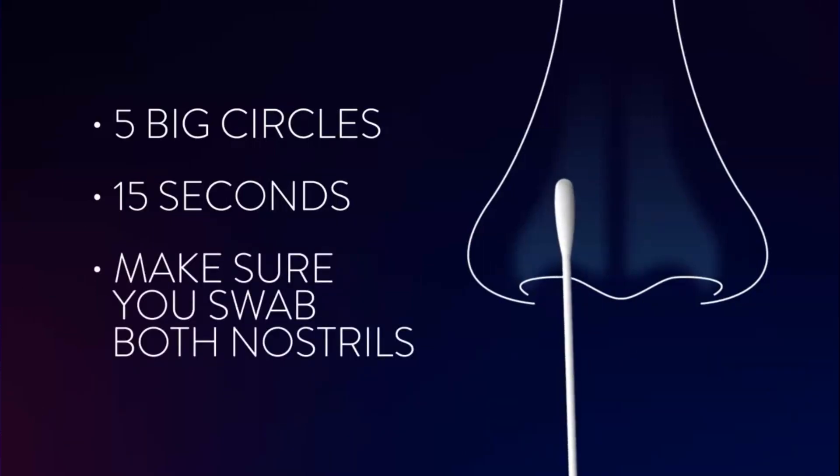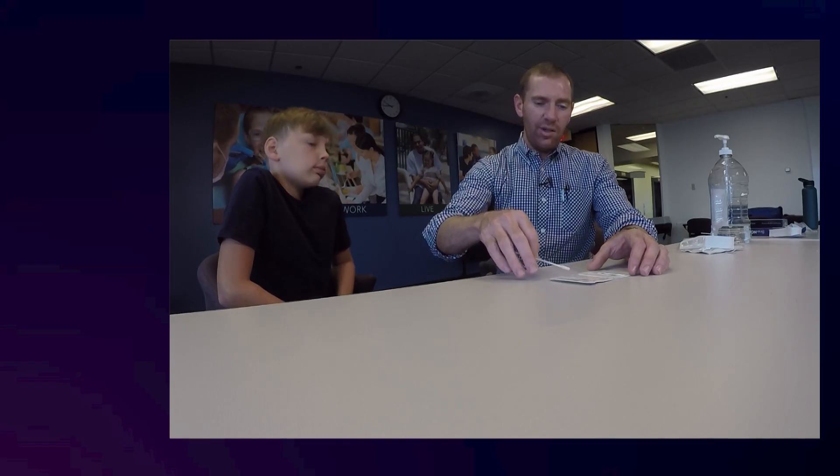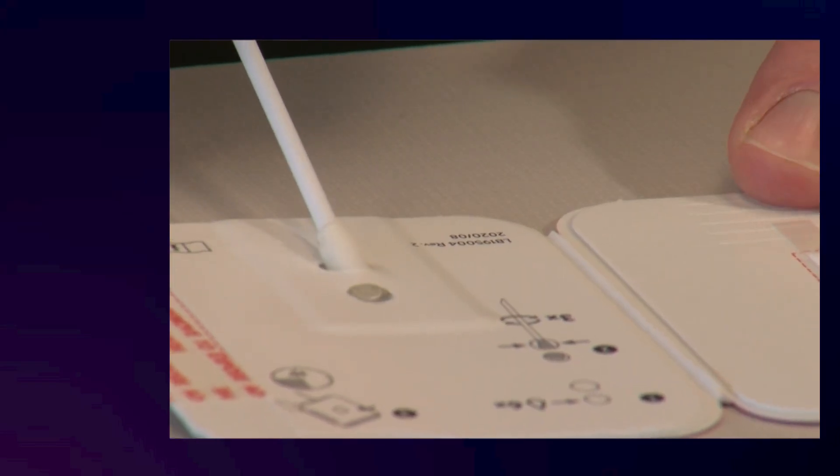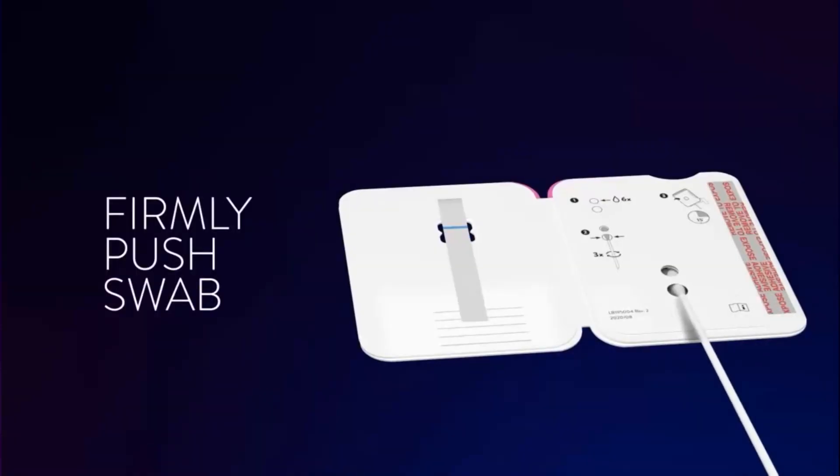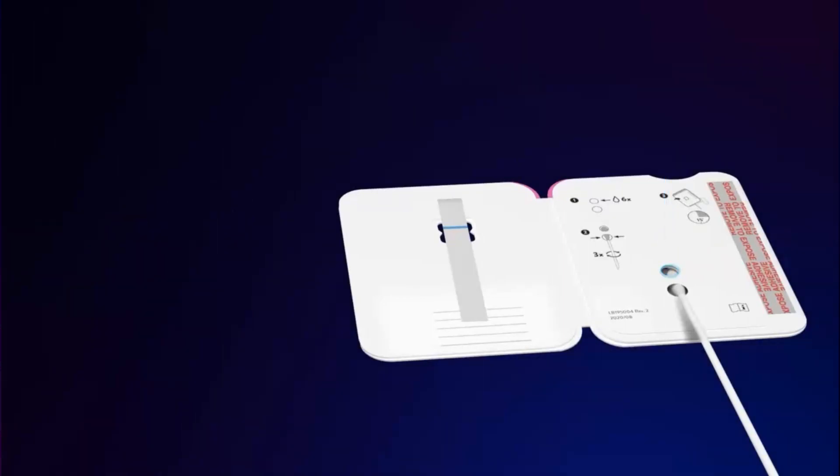Once you've collected the sample on the swab in both nostrils, the swab gets inserted into the lower hole on the card, just until you can see the swab in the top hole there. Then you're going to spin the swab in the hole to mix the swab with the solution.